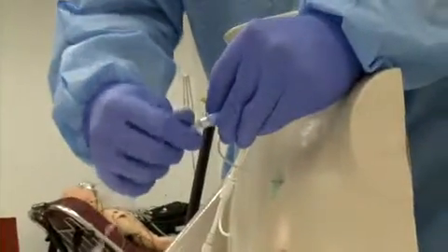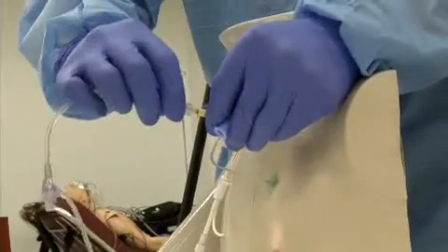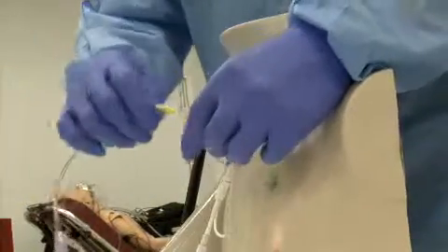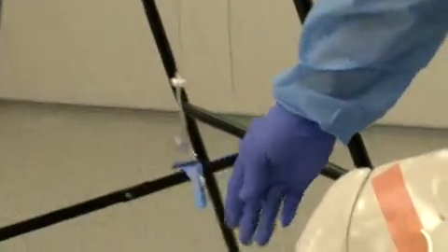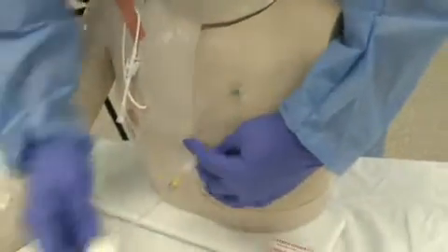Next, attach the IV tubing, engage the Luer lock, and open the inline clamp. Then open the IV tubing roller clamp and set the IV flow to the desired drip rate. Secure the line and Huber needle in place with tape.